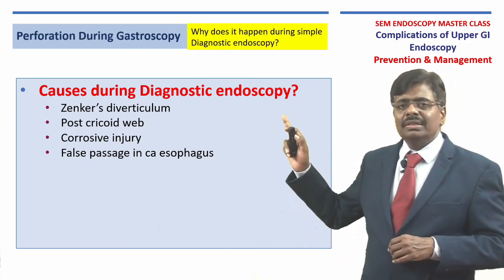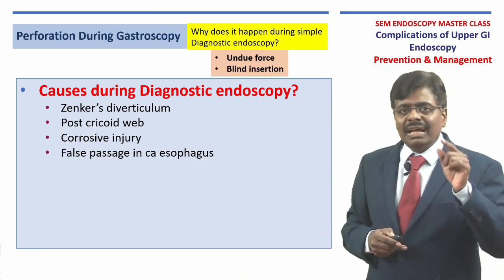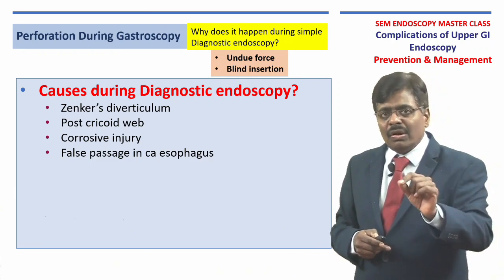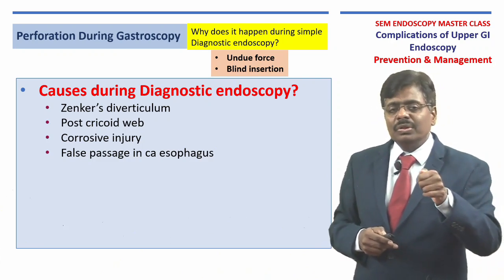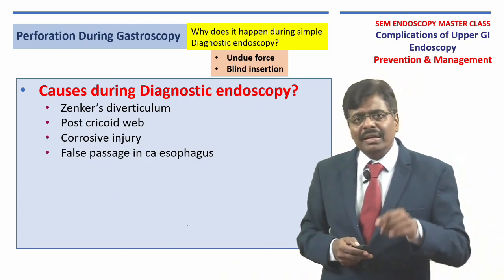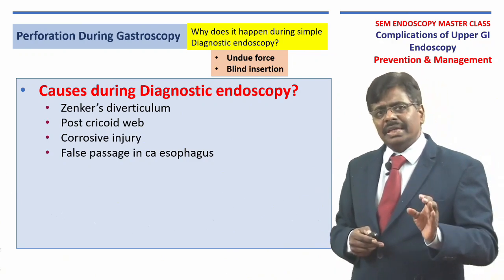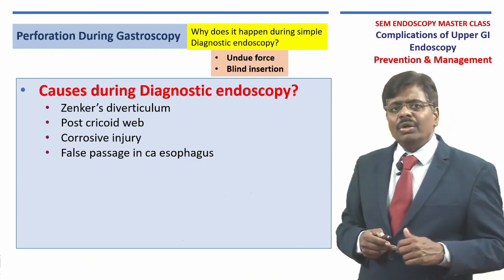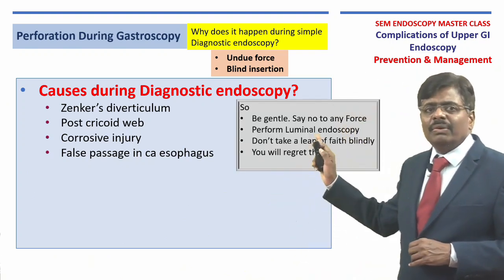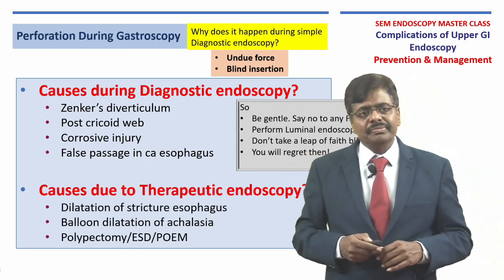So, it is always a very important thing in a simple diagnostic endoscopy: never use undue force, never do it blindly. When you are not clear, withdraw and have a look. Try a couple of times. There are one or two technical tips I can give you, like guide wire guided intubation. But when you are not happy, the best thing is to abandon the procedure, call your seniors, there is always another day. So, these are all the things I will say, never take a leap of faith blindly, or you will regret it.